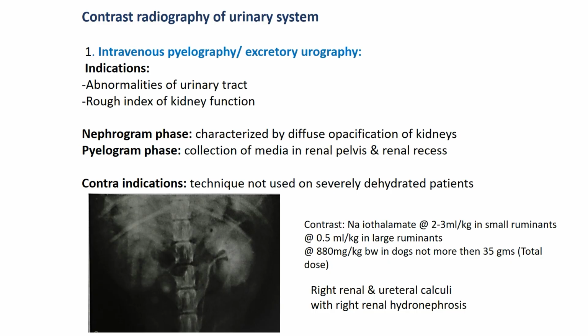Contraindication for this contrast radiography: you should avoid this procedure in patients who are severely dehydrated.